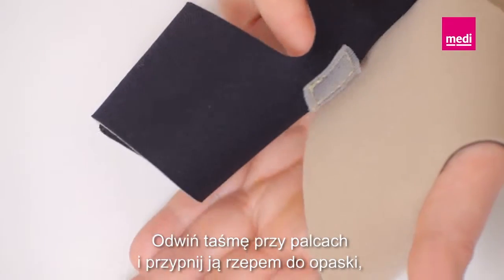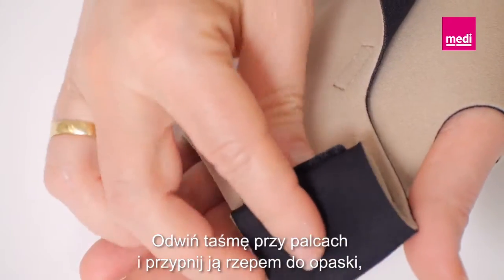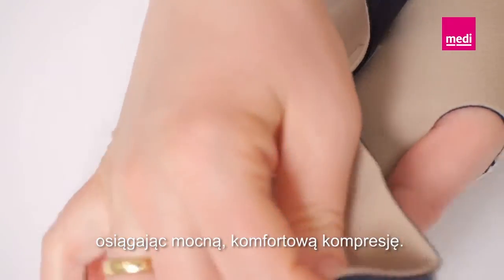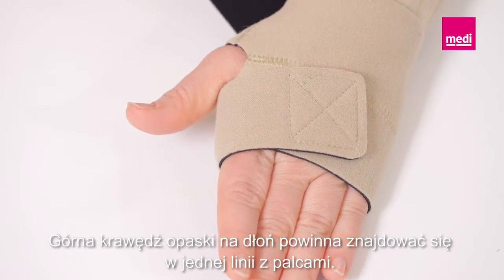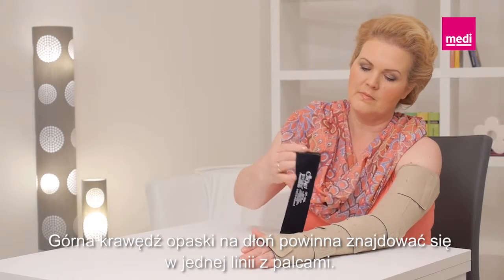Unroll the band closest to the fingers and secure it with the Velcro tab to the hand wrap with firm and comfortable compression. The top edge of the hand wrap should line up with the base of the fingers.